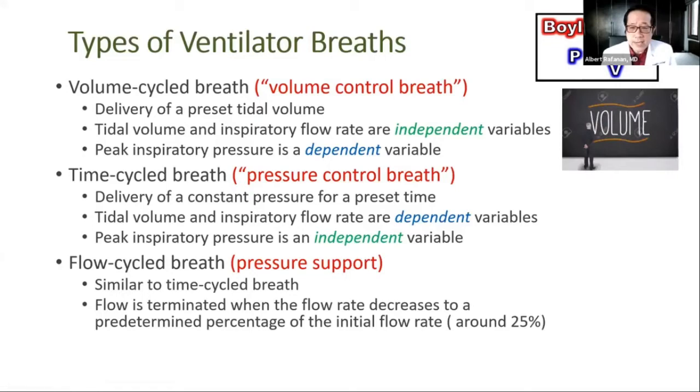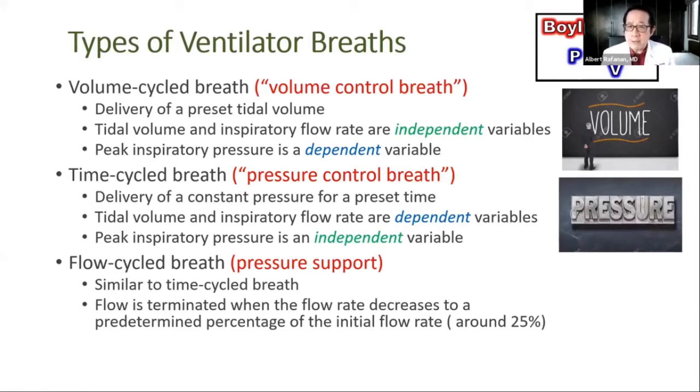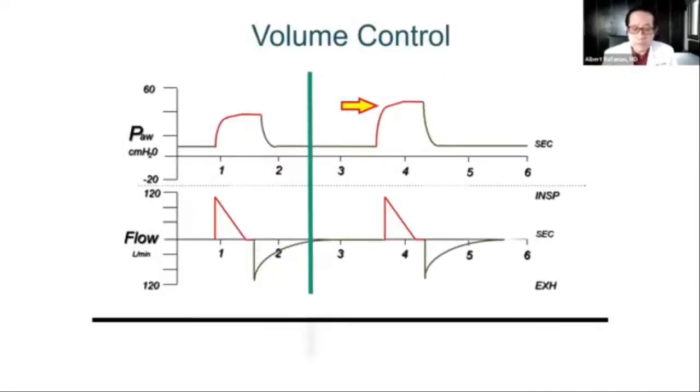So Boyle's law, again: a volume controlled breath is a volume you set. For a pressure controlled breath or time cycled breath, you set the pressure. And again, to reiterate physics, I hope you remember physics, pressure is inversely proportional to volume, or pressure is equal to 1 over volume.